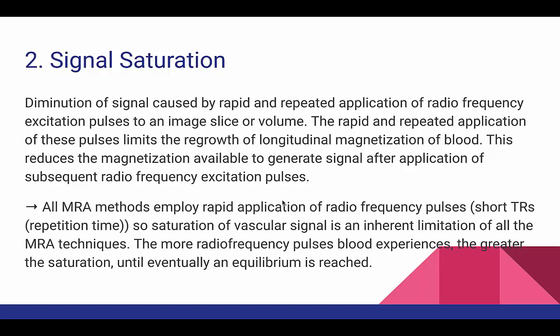All MRA methods employ rapid application of radio frequency pulses. We have a short repetition time. Therefore, it is an inherent limitation. You're going to have it with all of the techniques.